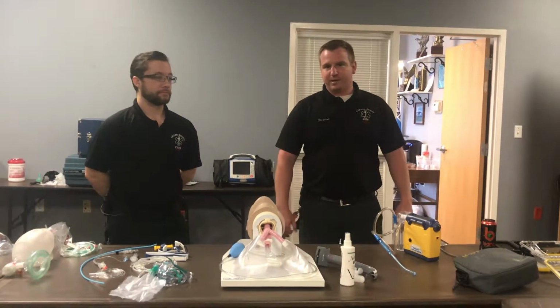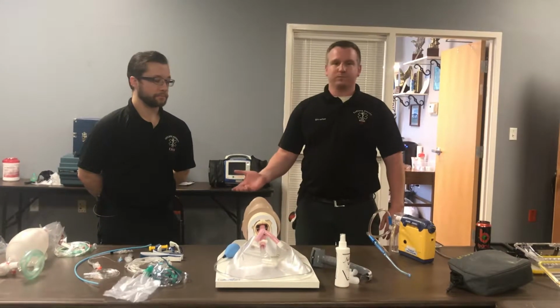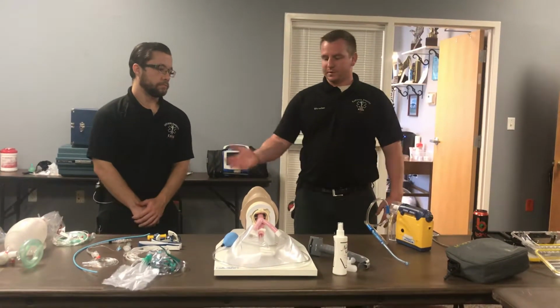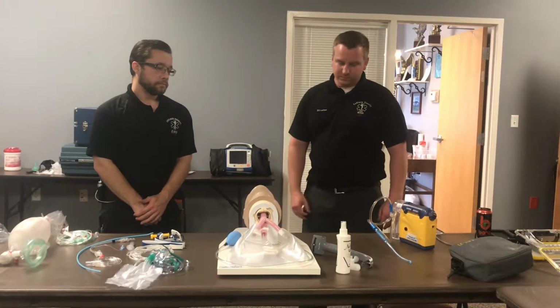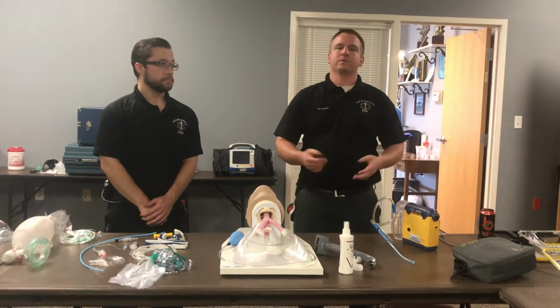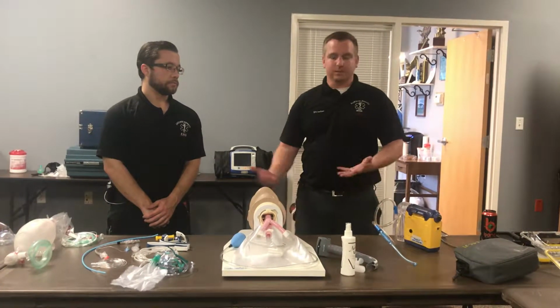Hello, Jeff Fishel, LeFlore County EMS, Levi Townsend, LeFlore County EMS, and we are just going to film a video here of our RSI procedure step-by-step here at LeFlore County EMS for our upcoming CE, and for anybody to reference in the future if they need to look back on it and restudy the process.